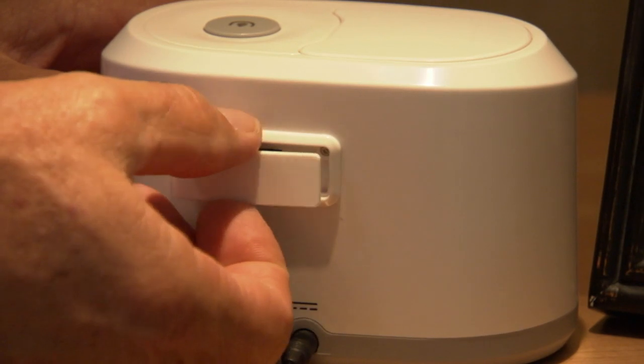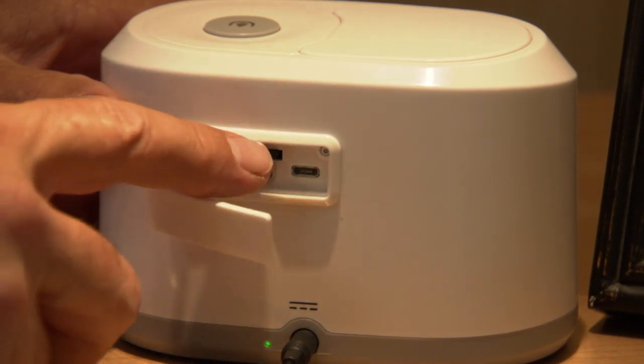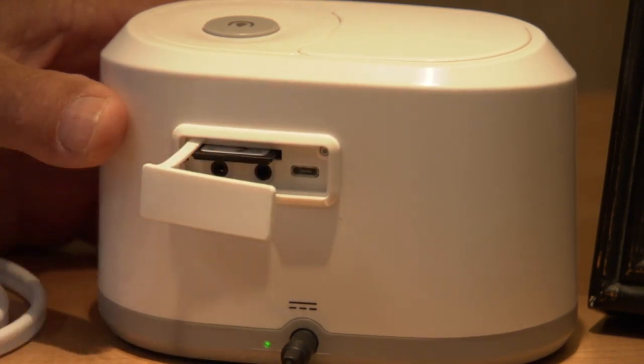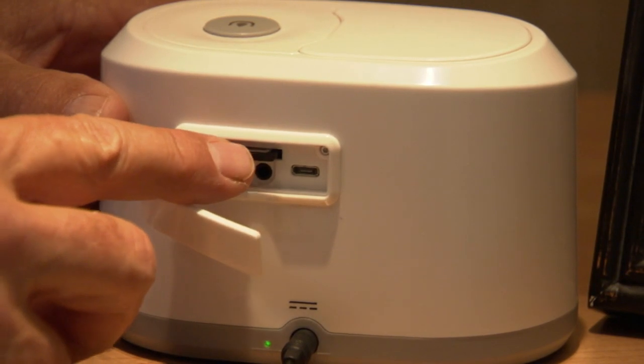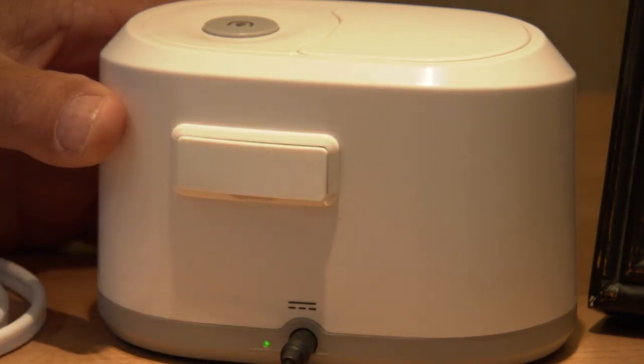Open the protective cover on the back of the console by lifting up on the bottom edge. The cover will stay attached to the back of the console. Check to ensure that the data card is fully inserted. The Winx System will track your use to help your physician evaluate and manage your therapy.